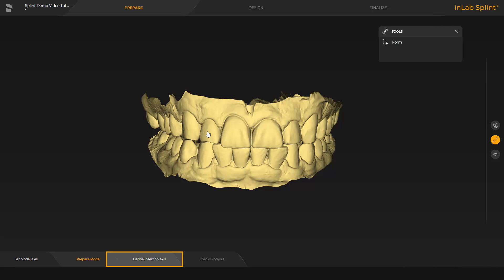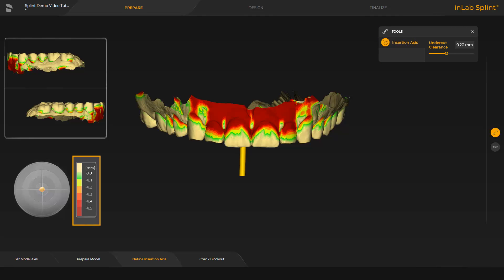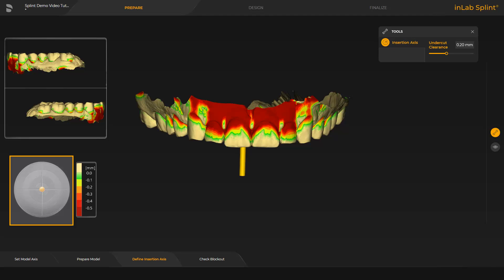Next, we switch to the define insertion axis step. The insertion axis tool allows you to set the axis for blocking out the jaw. The undercut depth is visualized using a direct color gradient, from light green for a low depth to dark red for a great depth. The insertion axis itself is displayed with the yellow arrow above the center of the jaw. To adjust the axis, you can move the arrow with the left mouse button, or via the disc and the orange colored ball.